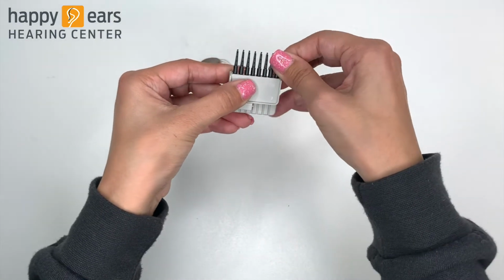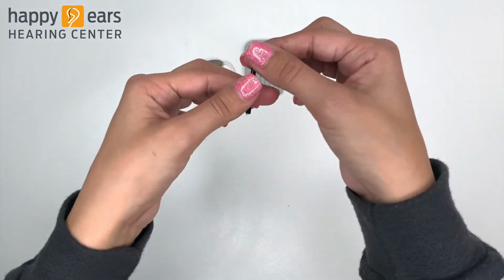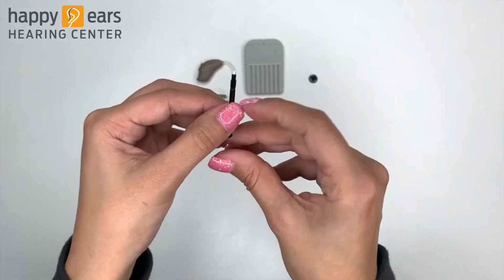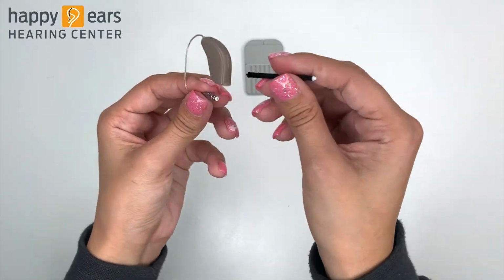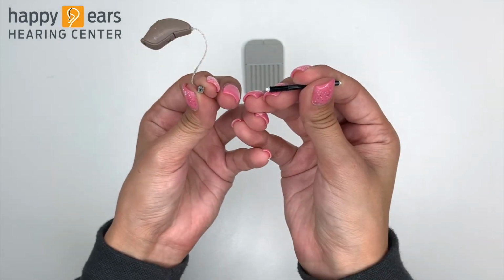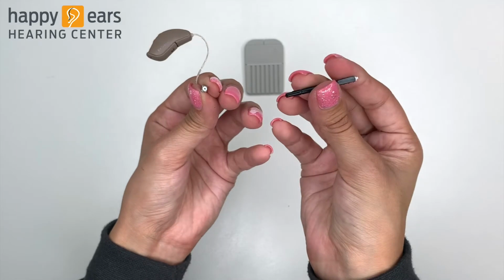Open the wax filter kit and remove one of the black sticks. On one end of this stick is the removal tool, and on the other end of this stick is the new filter. Snap the wax filter removal tool into the receiver, spin it around, and push the new filter into the receiver.